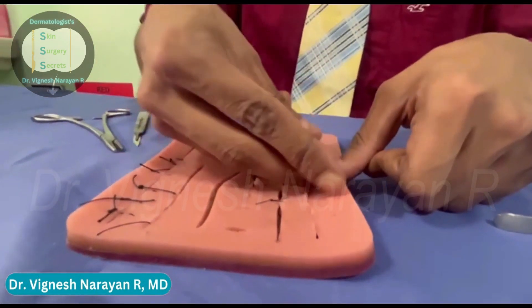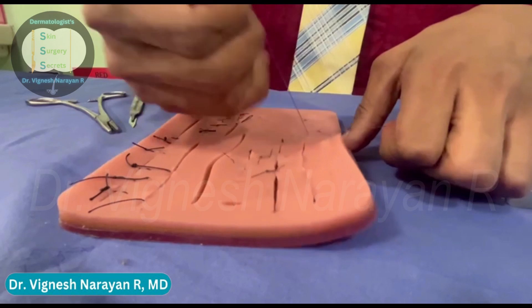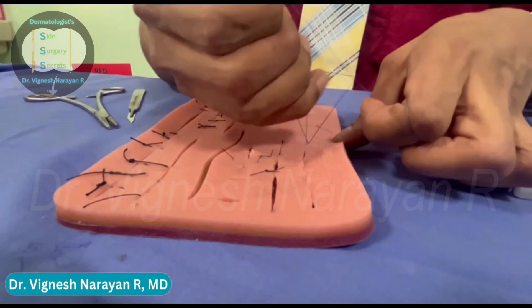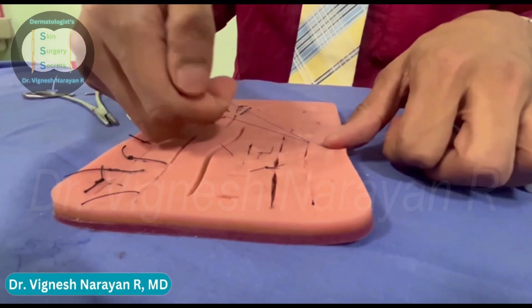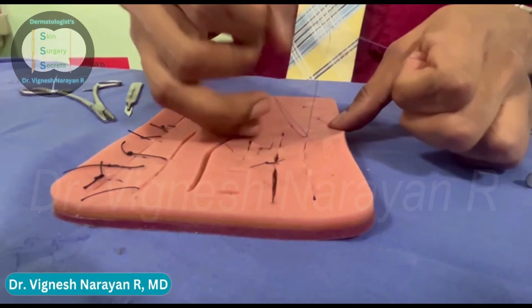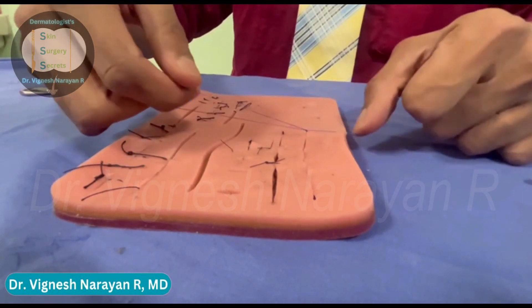Here you can see I'm maintaining the loop, and with my other fingers I'm pulling the needle end of the thread through. The needle end of the thread remains stationary while I rotate my right hand outwards. I'm holding the needle end of the thread and rotating it outwards — you can see the loop is still maintained and a knot is being formed. I'm holding the needle end straight, not moving it much, and pulling with my right hand outwards to put a knot. There you have it — you have an Aberdeen knot.